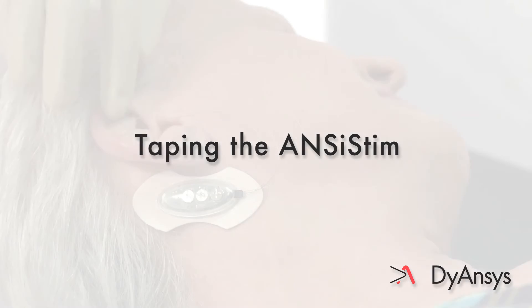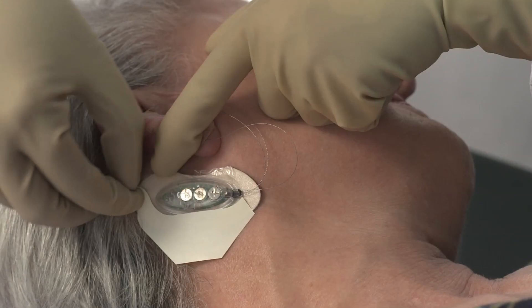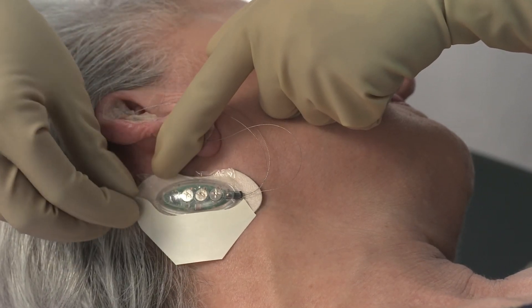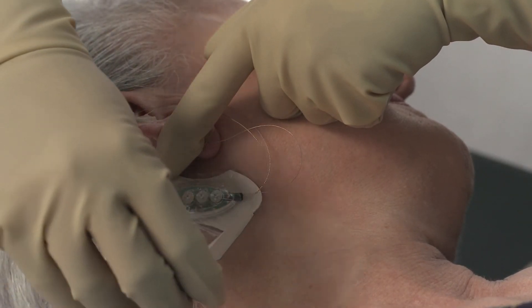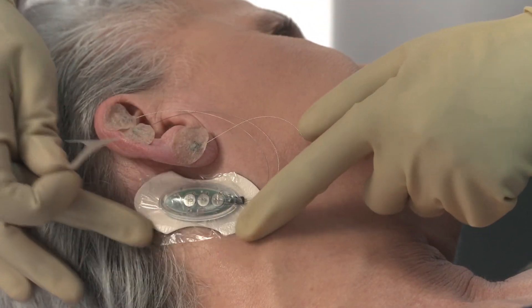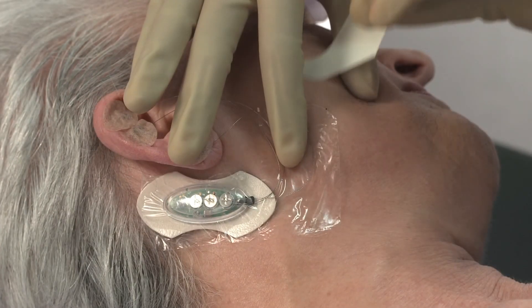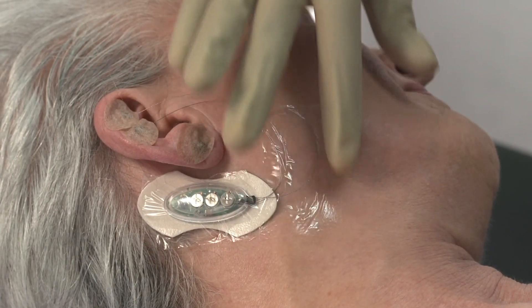Taping the ANSiStim. Cover each needle with the supplied oval adhesives. Cut the Tegaderm tape into two pieces. Position the first piece over the ANSiStim control module. Apply the second piece of Tegaderm tape over the wires.